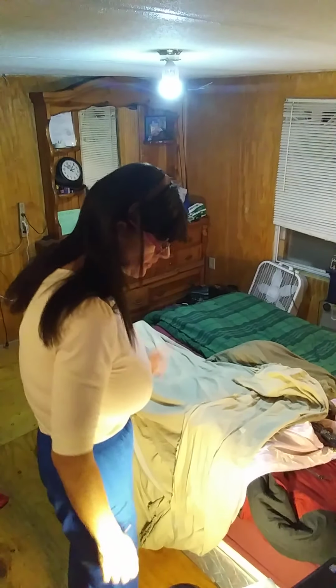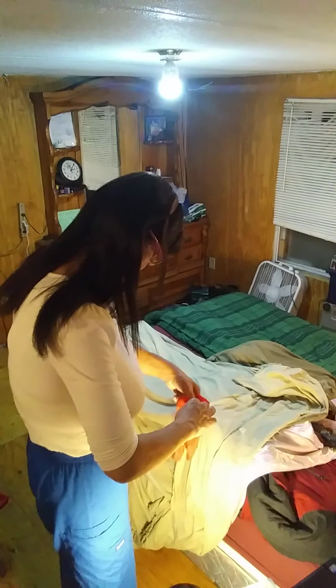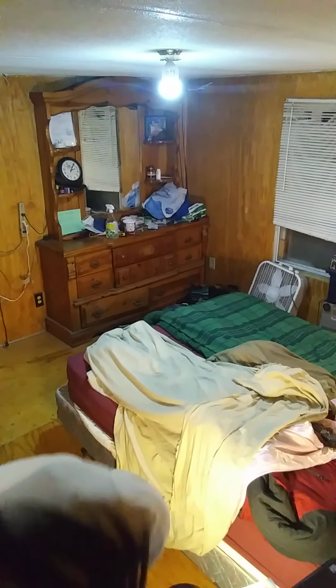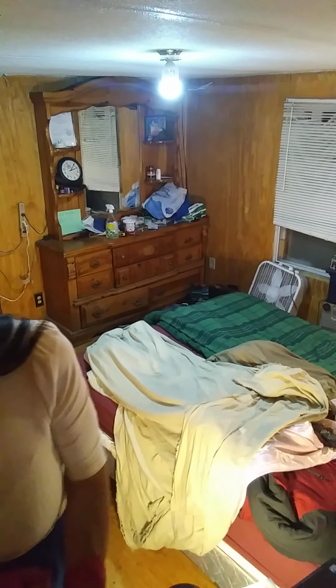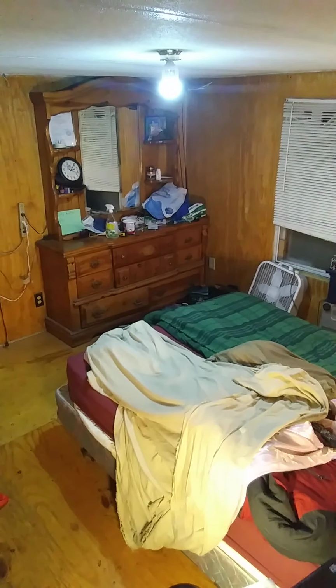Alright, I'm going to put a second pair of gloves on. And I'm going to get rid of my dirty supplies. Okay, so I'm going to dump out the basin. And then I'm going to rinse the basin in the sink.